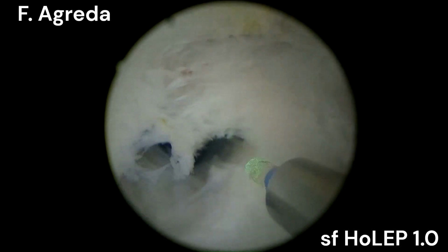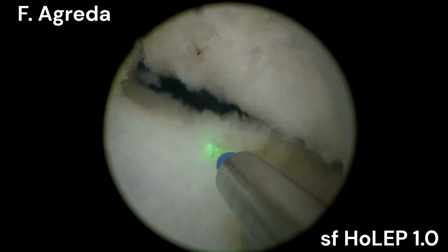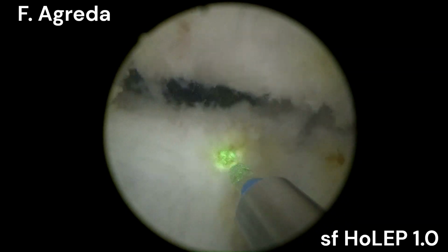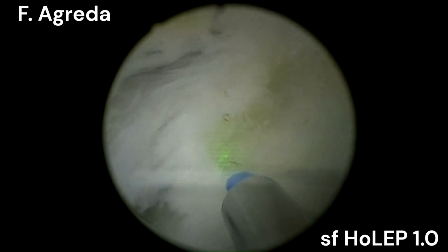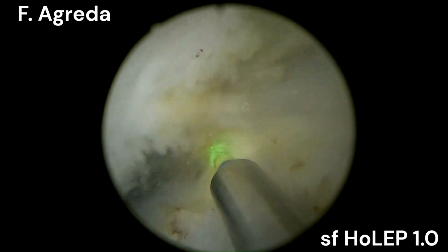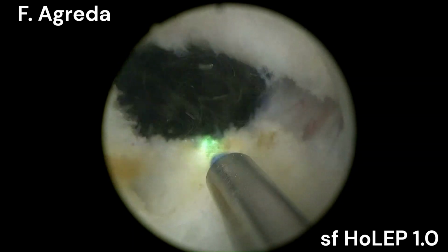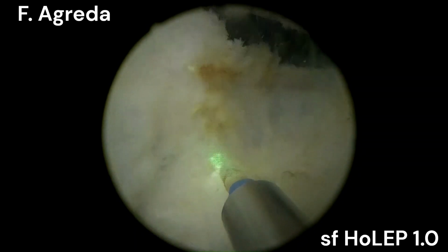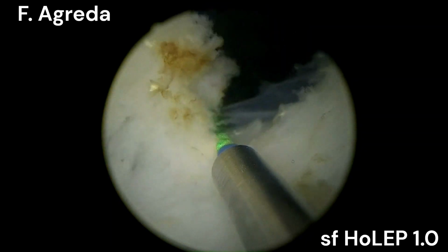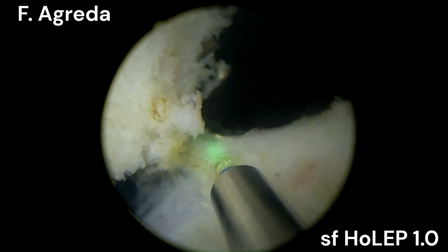So this is bladder mucosa attached, that is getting between this progressed, already done adenoma that's completely detached. So you just have to connect these two. That's it. Always stay very close to the capsular fibers to avoid leaving any adenoma on the capsule, so as not to forget any rest of adenoma in the prostatic fossa. That's it. You get very attached to the adenoma. That's it. You complete it here.